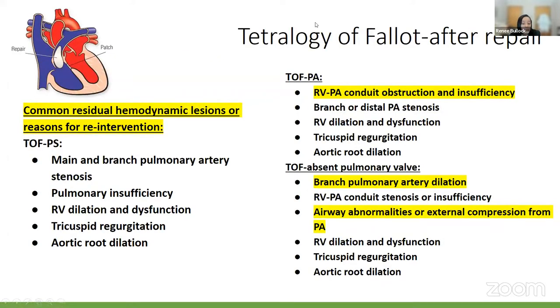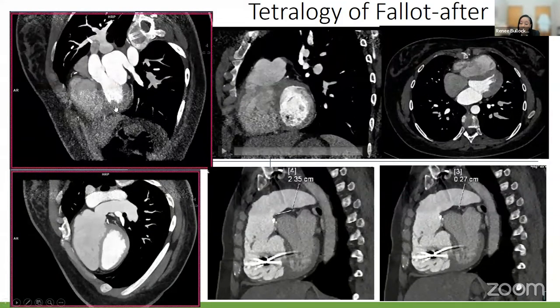Moving on to tetralogy of Fallot — in the adult clinic, these patients often present with sequelae of their repair. In adulthood, they may have significant pulmonary valve insufficiency, or pulmonary valve stenosis from valvuloplasty leading to supravalvular stenosis. They can also have pulmonary artery dilation and branch pulmonary artery stenosis. Here is an example of a patient with tetralogy of Fallot showing a massively dilated RV, who had significant pulmonary valve insufficiency and was referred for the Harmony valve protocol — evaluating measurements for percutaneous pulmonary valve replacement. You must assess not just the sizing of the pulmonary artery and annulus, but also where the left main is relative to the pulmonary artery and the distance from the pulmonary valve annulus, as this has implications for valve type and size.